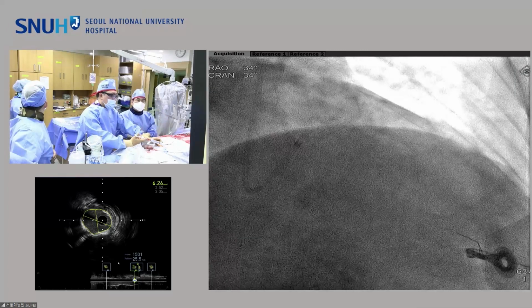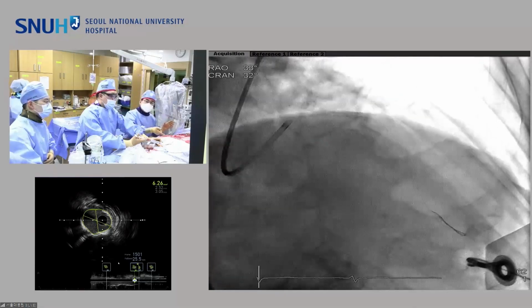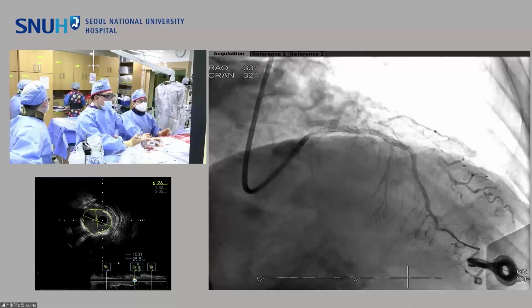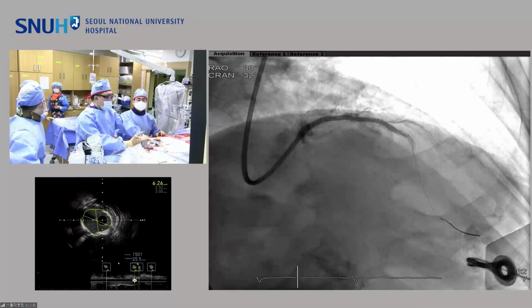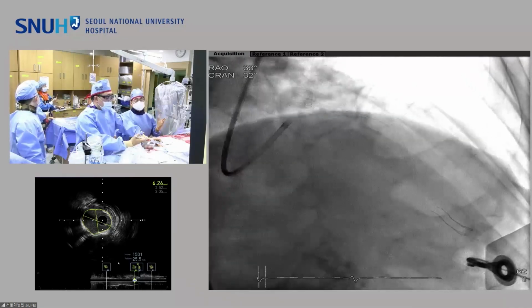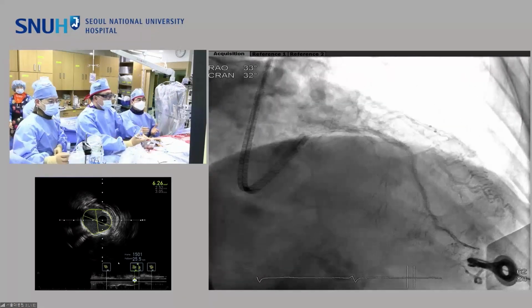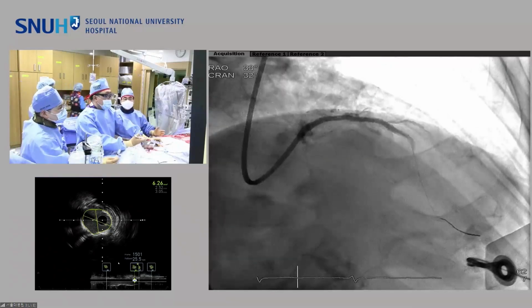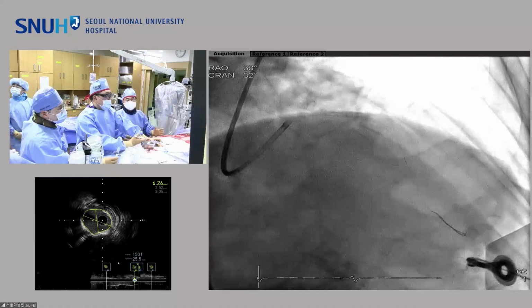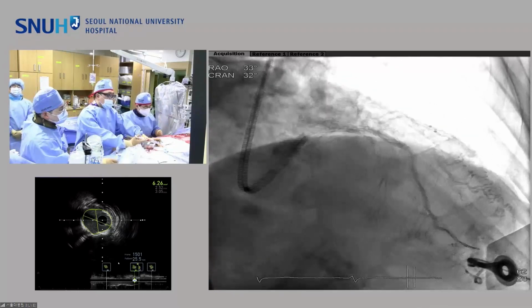Heparin is very similar in structure to heparan sulfate, a component of extracellular matrix. Heparin is very sticky, so if you infuse heparin in such a plastic tube, a substantial amount of heparin is attached to this vinyl tube. With this concept, I thought about coating the coronary artery with heparin. That may stay at least 1 or 2 days. I think the acute phase after stent or vascular damage is very important. When platelets adhere, that may play as a nidus, then thrombus grows, and several months later we observe such an early event as restenosis. I guess in some patients, such as complex calcified lesion or CTO lesion, the early deposition of platelets and minor thrombosis may be a kind of nidus trigger for late in-stent restenosis.